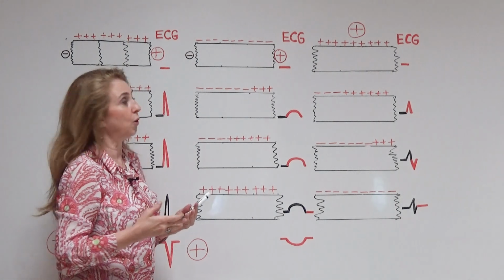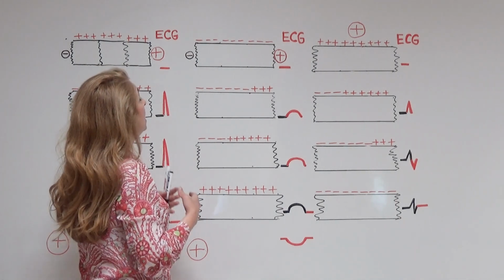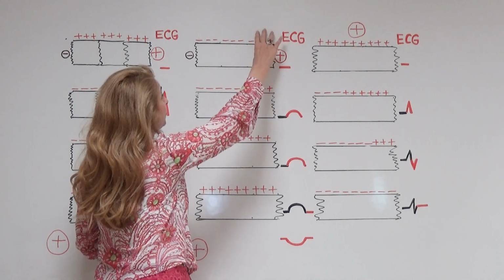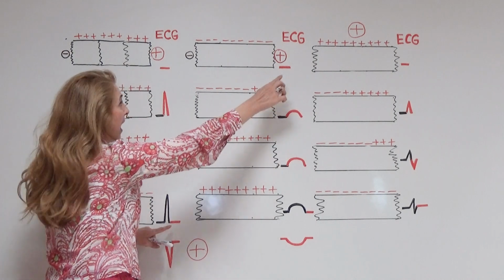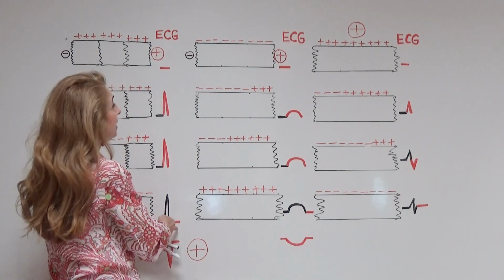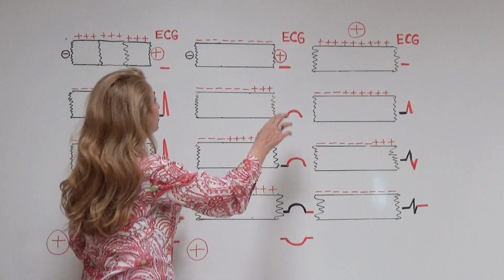They are at the plateau phase of the action potential. So the outer surfaces of all of them are negatively charged. Because there is no dipole, the electrocardiography is going to record an isoelectric line. This isoelectric line is actually this isoelectric line at the end of depolarization. It is the isoelectric line between depolarization and repolarization.